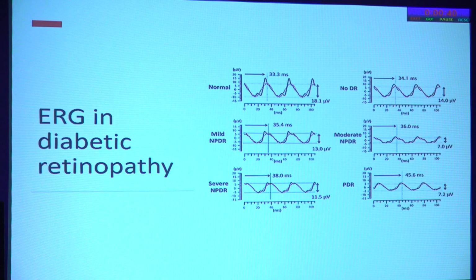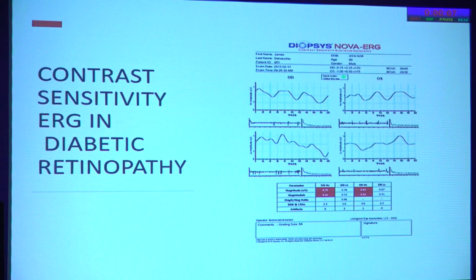In diabetic retinopathy, again, you can catch these things very early. But whether at that early point, you're justified in starting treatment on the patient or applying a laser on this patient, or are you going to now earmark this patient for more close follow-up over a period of time? That is left to our interpretation, what we do. So probably what we will do at this point of time, not rush into treatment, but you would probably now see this patient every 3 months or 6 months instead of seeing him once in a year. So that gives you a very good early diagnosis for all of these conditions.